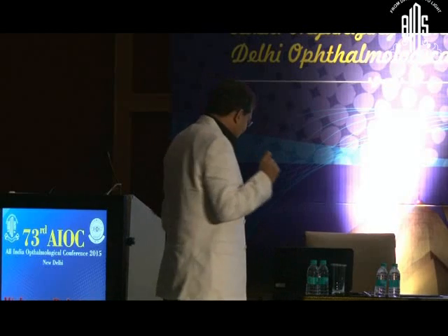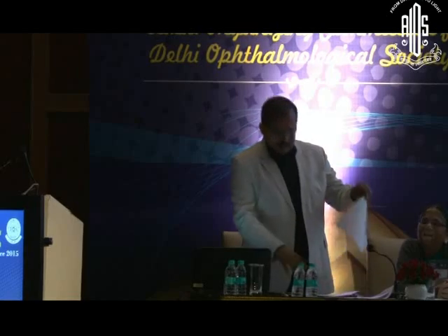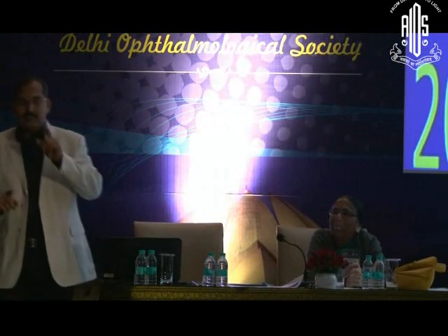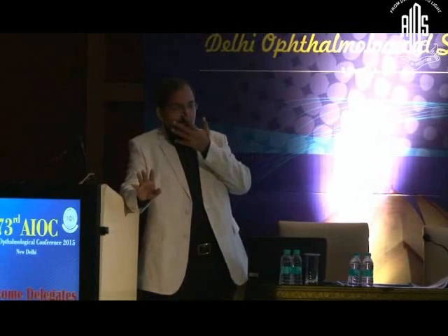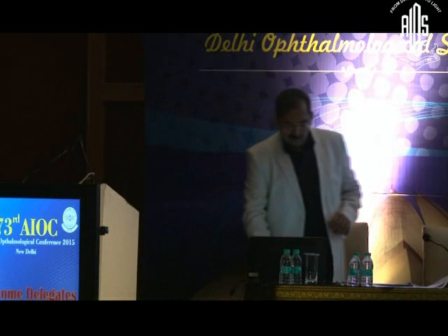So Jackson's cross cylinder. How many of you have used it? No, don't be ashamed because nobody uses it anyway as PGs. But let me tell you, it's a very good tool for somebody who's interested in doing a subjective refraction. It's a subjective verification of sphere and cylinder. I'm going to now just quickly go through what is cross cylinder.